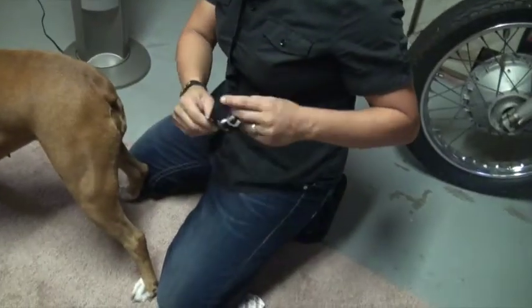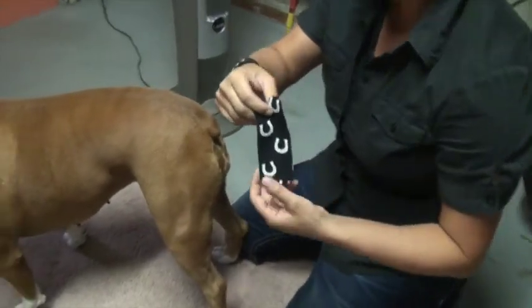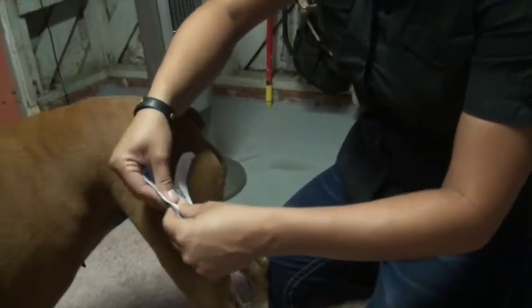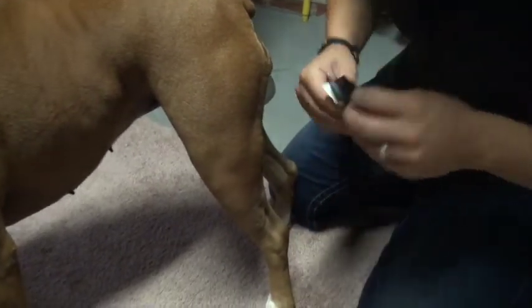So we're going to start off, I'm actually going to use the horse tape. It's made for horses, but it's a little bit stickier, so it works well with dogs too, especially when we're taping the joint area. So I cut it into a Y, and we're going to tear it down at the base. And we're going to take the paper off on this bottom base part, and I'm going to lay the base.